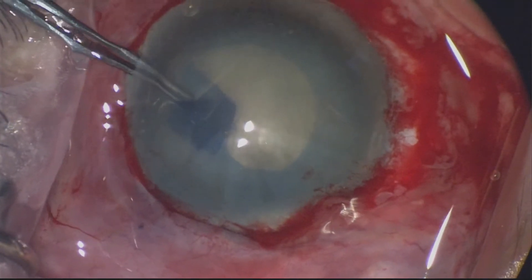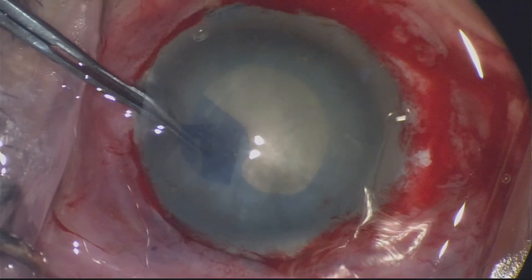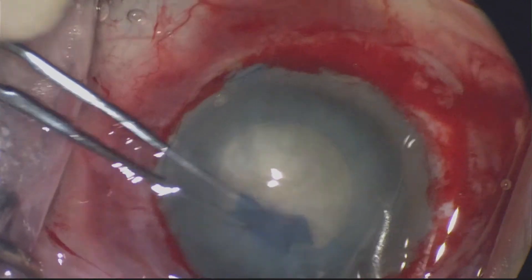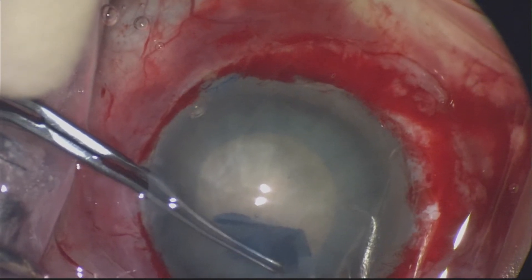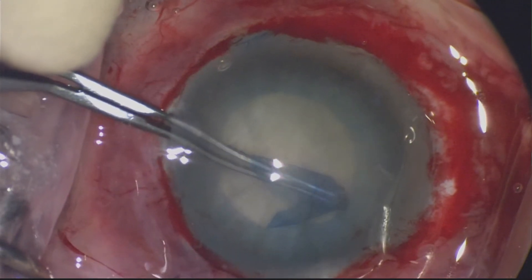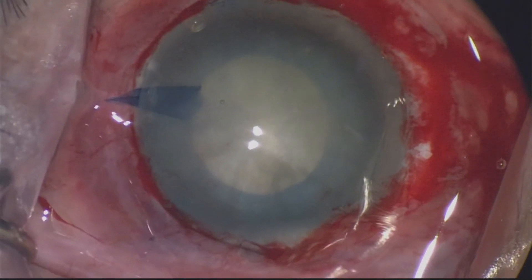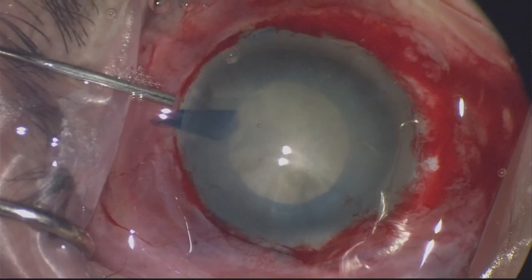In these cases you want to take your time, control all aspects of the operation that you can, and minimise risk. At the same time, you don't want to spend too much time deciding your next steps — while you're operating, you should always be thinking ahead about what you need next and what to ask the scrub nurse for.